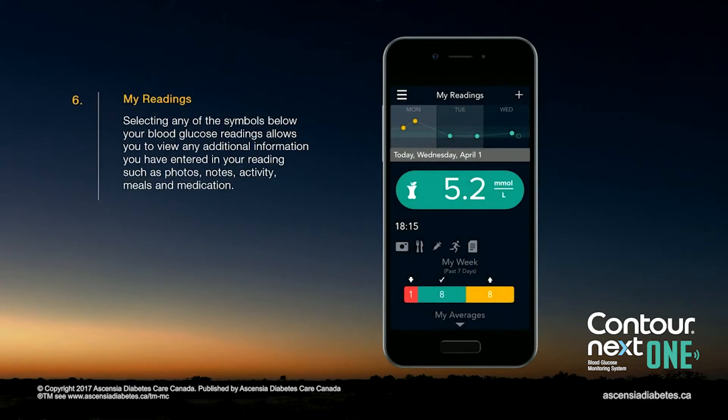Selecting any of the symbols below your blood glucose reading allows you to view any additional information you have entered into your reading.